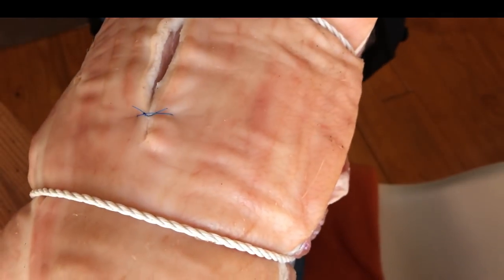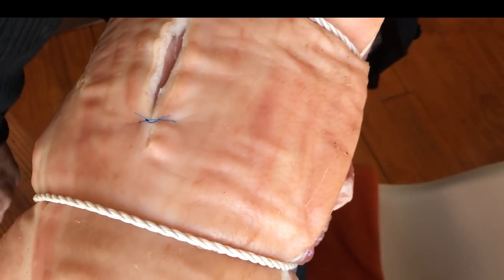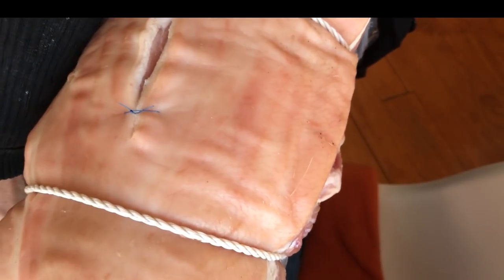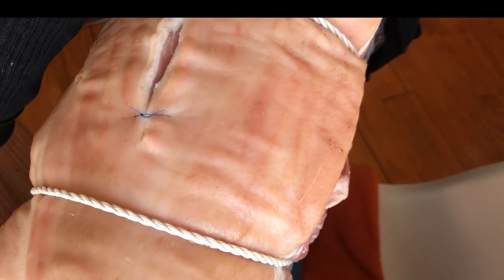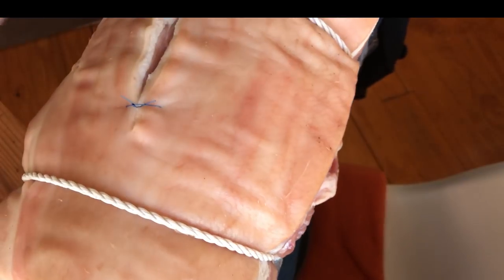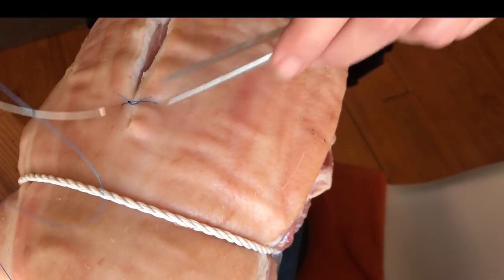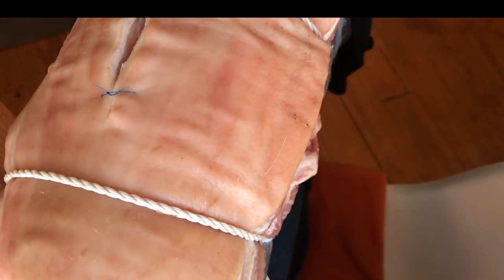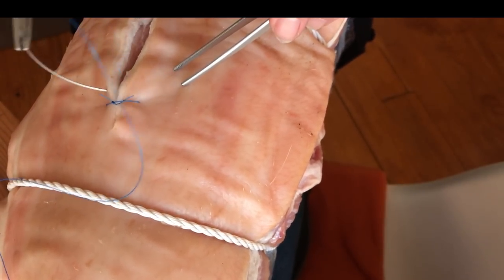I must say the video seems much easier than actually doing it. And I think, bearing in mind being stressed out and whilst everything's going around on the boat, it takes a bit of concentration. Now also the distances here depend on the length of the wound and how deep it is. So let's try about a centimeter apart.